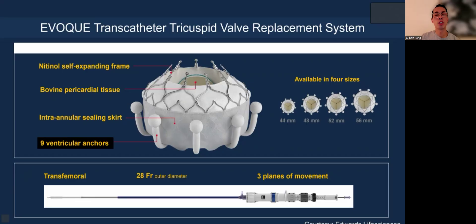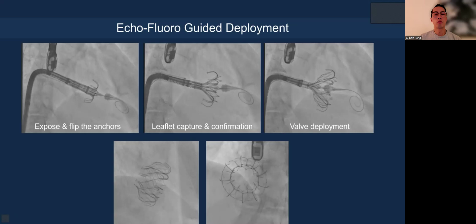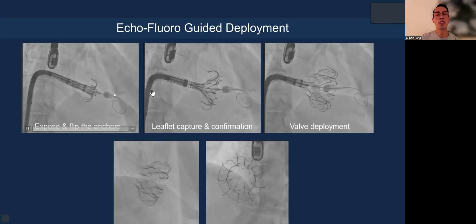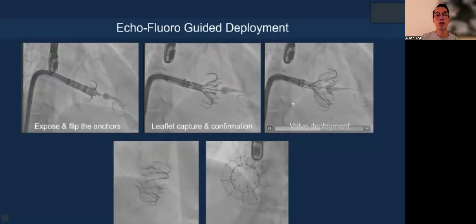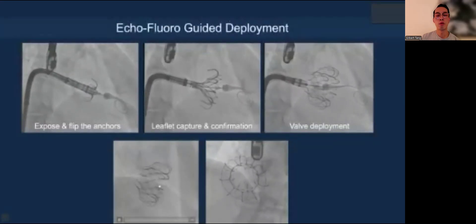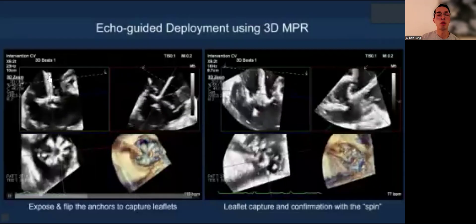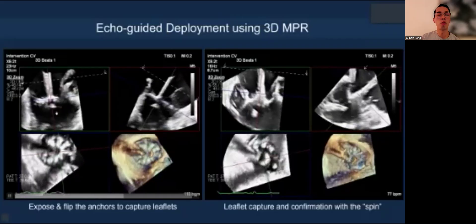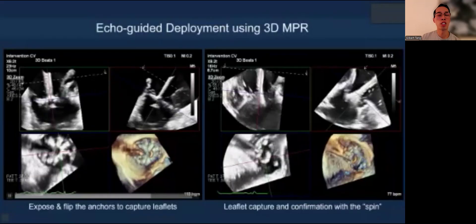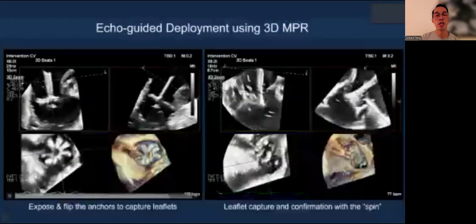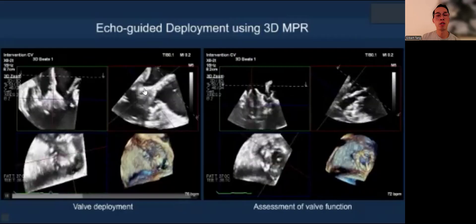For the TTVR procedure, the EVOQUE system is approved in both Europe and the US, with four different sizes. It's both echo and fluoroscopy guided. On fluoroscopy, you can see how to expose and flip the anchors, as well as the trajectory, tilt, and orientation of the catheter, and observe the valve being deployed. On echo, this is done with 3D MPR on TEE — the green box shows the inflow view, the red box shows the perpendicular septolateral orientation view, and the blue box shows the transgastric view displaying all nine anchors to confirm leaflet capture before committing to deployment.